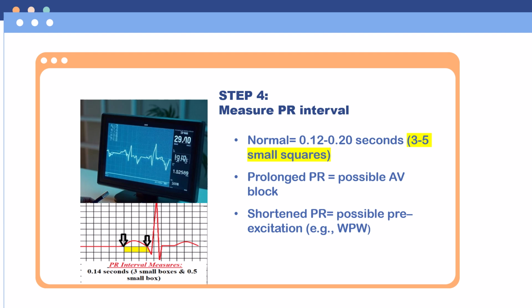It is a very rare disorder, and if you can identify this, you can save a very important life, because it is a type of irregular heartbeat. It comes just before an irregular heartbeat, maybe just before atrial fibrillation, you can see this WPW syndrome. It is generally due to the electrical system, some sort of disturbance in the pathway, which is very rare to find, because generally patients come here with either atrial fibrillation or an MI.